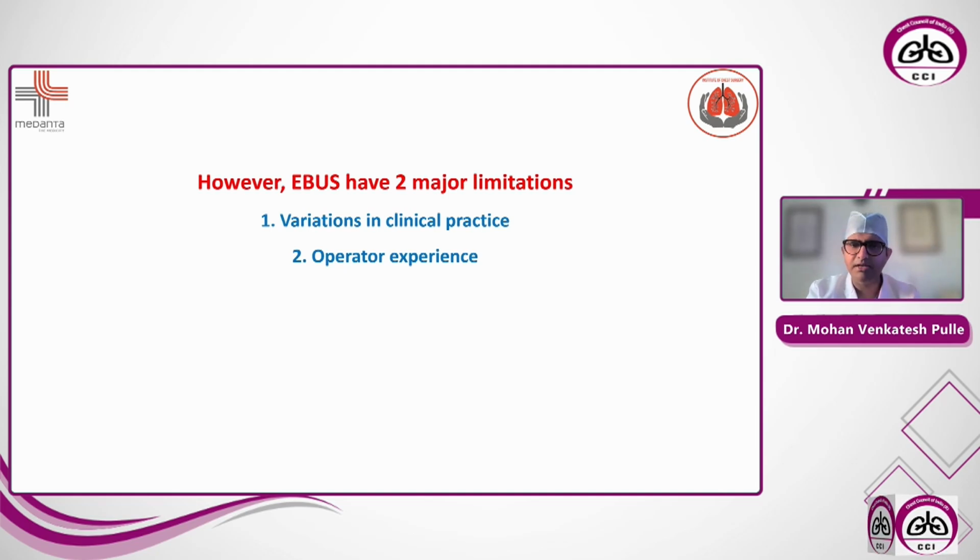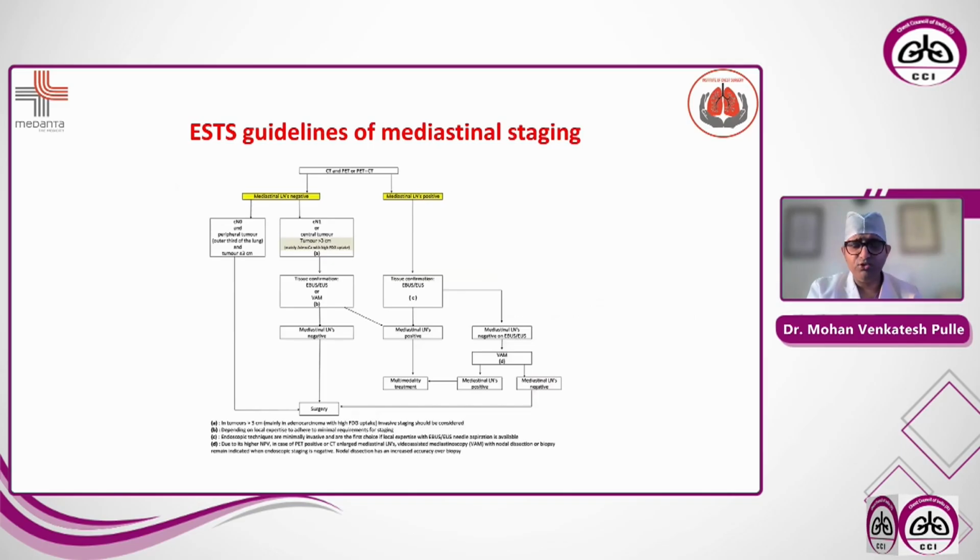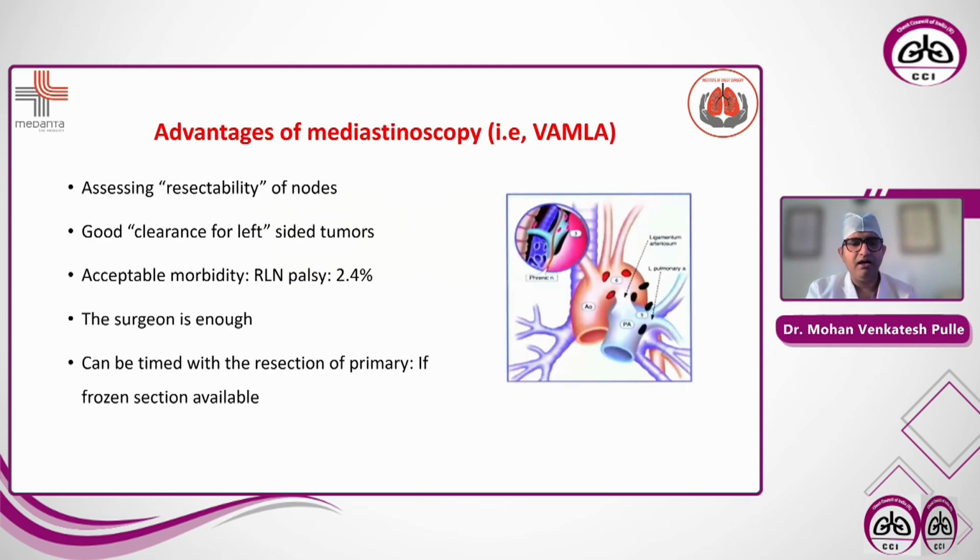However, EBUS has two major limitations: the variations in clinical practice and the operator experience. The question is, are EBUS results reproducible? As I said, it's operator dependent. Single center experiences have false negative rates of almost 20%, which is a very high price to pay in lung cancer. So that's why the ESTS guidelines in 2014 have said that even if the EBUS is negative, we have to plan for mediastinoscopy to prove them negative and then plan for the surgery.